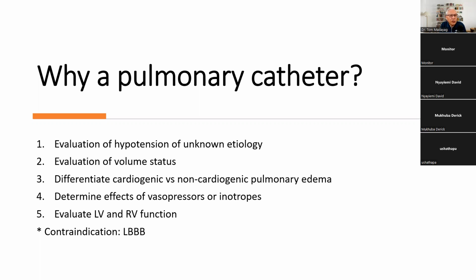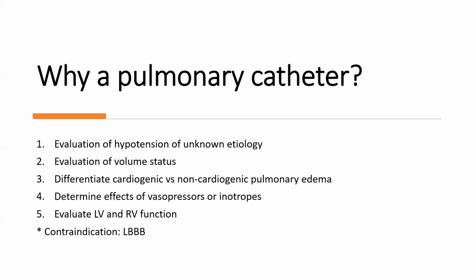But now technology has brought us to a far more advanced mechanism to measure hemodynamic pressures within the heart or the cardiovascular system.